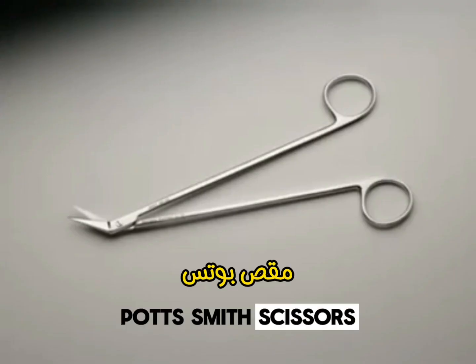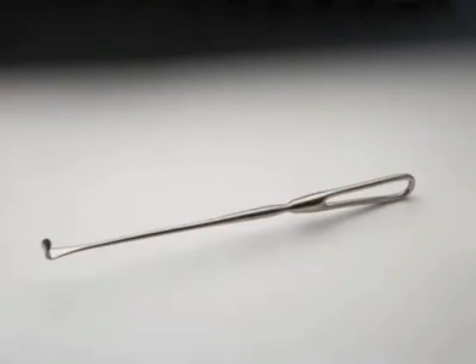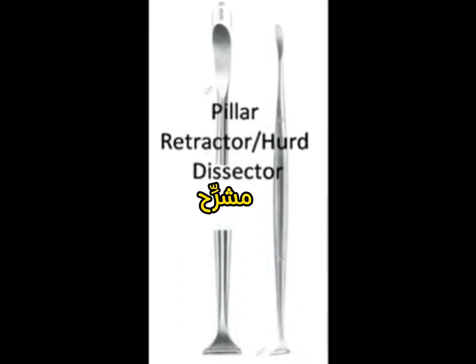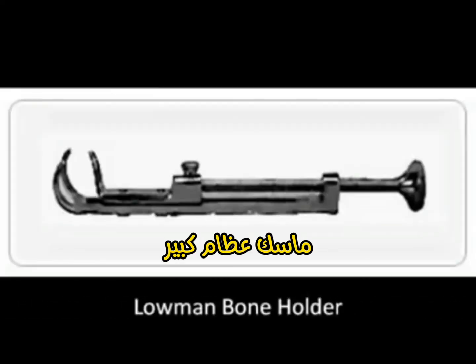Potts Smith Scissors. Cushing Vein Retractor. Cushing Vein Retractor. Pillar Retractor. Hurd Dissector. Lowman Bone Holder.